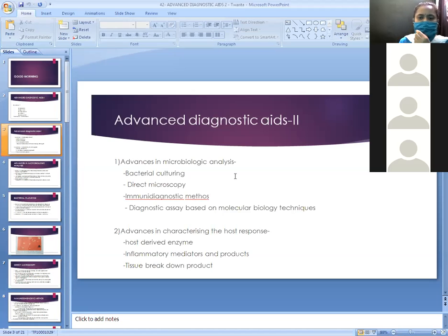In computer-assisted software, you can place these radiographs in superimposed position, and unchanged anatomic structures like the tooth can be removed, and you will be able to find in the grayscale image whether bone formation has occurred. Then you will see more radiolucency. Radiolucency is detected as a defect and radio-opacity is formation, so you will be able to find whether bone regeneration has taken place or not. So you sequentially arrange radiographs over each other and subtract the unchanged anatomical structures, and you will find whether bone regeneration has occurred. That is subtraction radiography, or digital subtraction radiography.